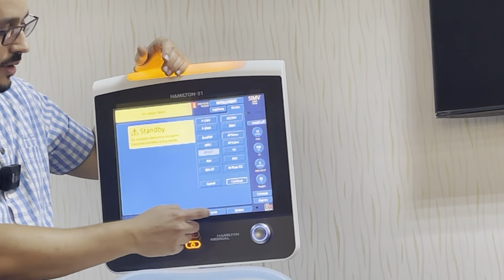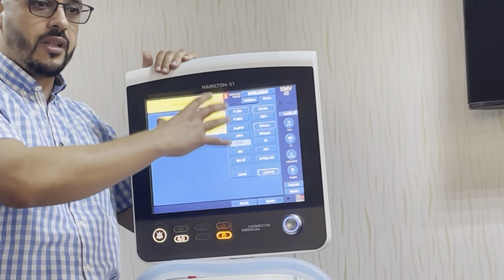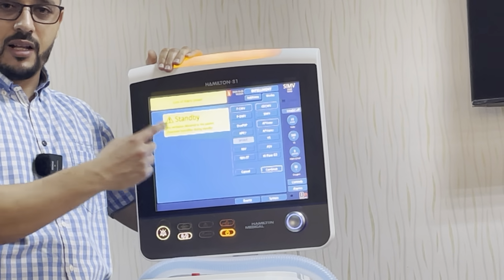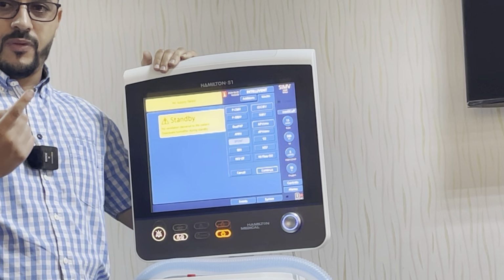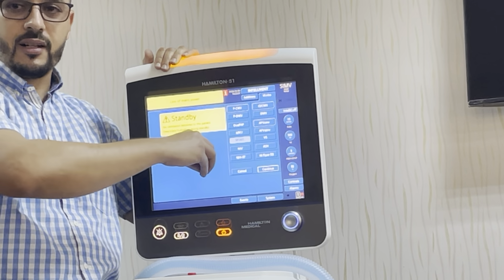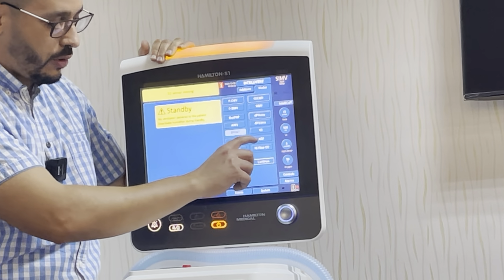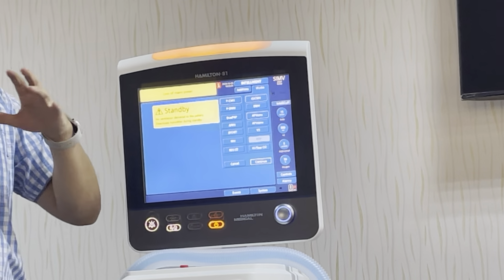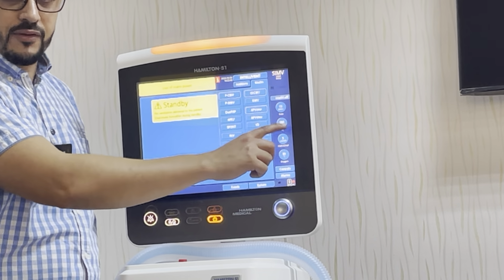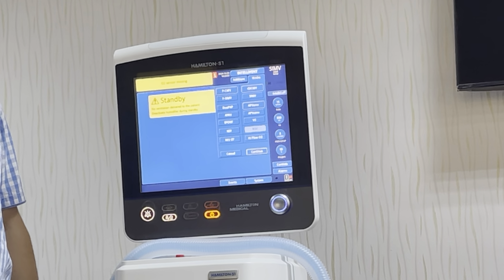اوكي. الهاملتون شنو داروا تو؟ قالوا احنا عوض انه نخلوا الدكتور او الدكاتره يختاروا بين الغابه هذه نتاع المودز، خلوا نعملوا وان ستاندر مود اللي هو ماهوش مود في الحقيقه، هو الجوريثم اللي باش هو يختار المود الانسب للبيشنت. يعني الالجوريثم تاع الاي اس في الادابتيف سبورت فنتيليشن it's like a combination of all these modes in one mode. لما تحط الاي اس في the machine will select the appropriate mode according to the patient condition.